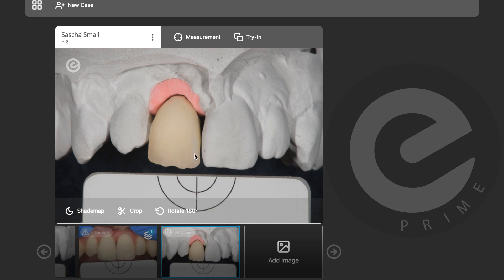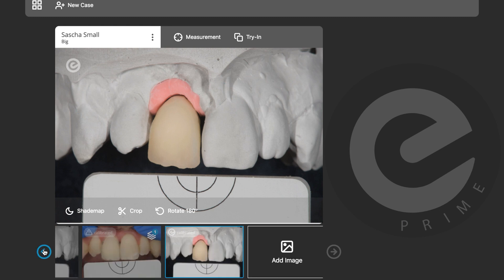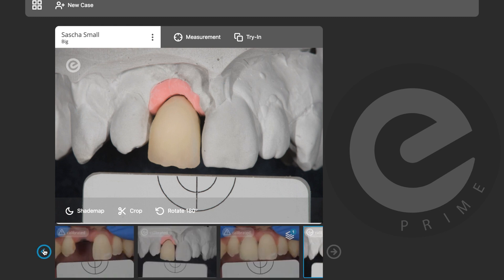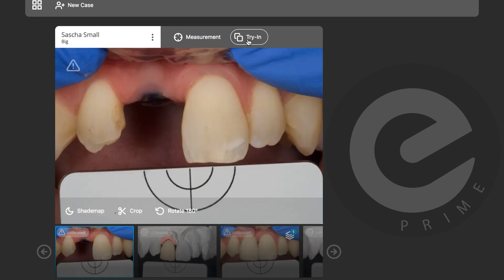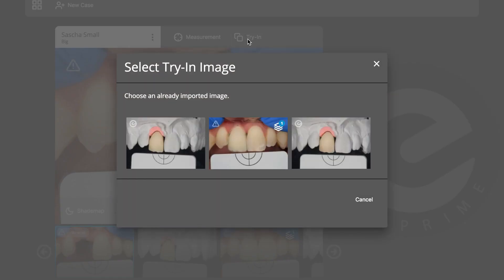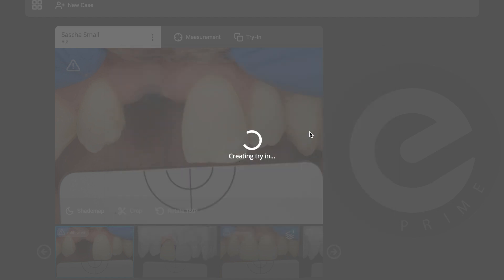You can see the nice bluish area here and it's a bit more reddish in this area. I can do a try-in again and see if I'm closer to the final result. I'll go back to the main picture and click Try In.